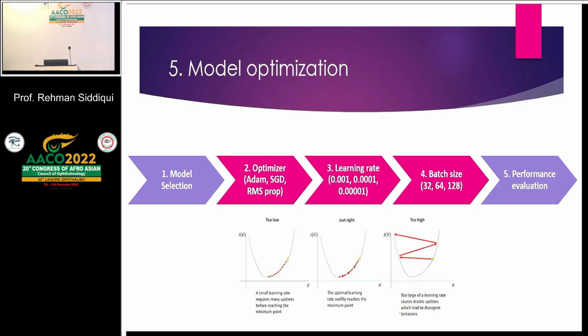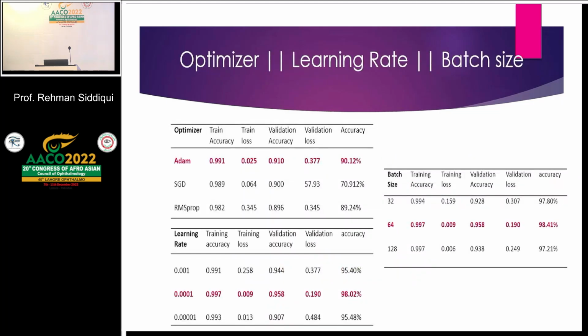Third hyperparameter is batch size, which is another important hyperparameter that controls the number of sample images for the network for our training iteration. The batch size controls accuracy of error gradient estimation when training neural networks and is very important during training. So these are our results for hyperparameter tuning.